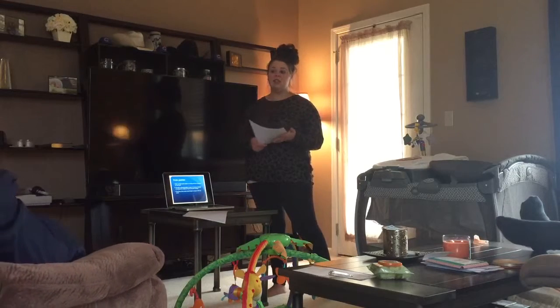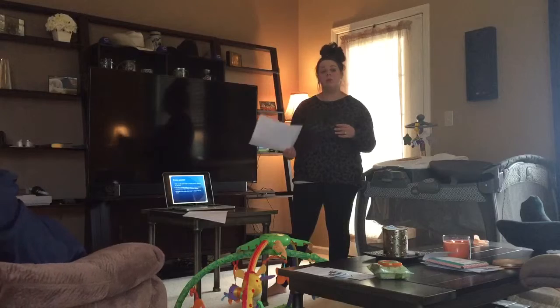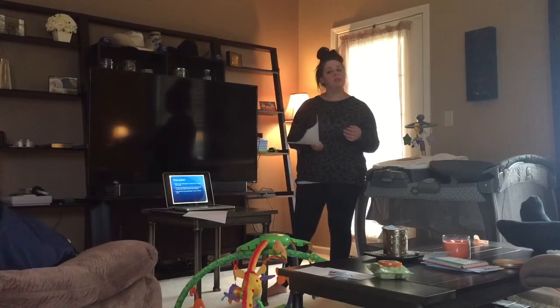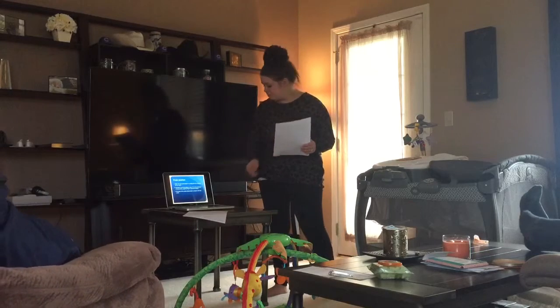Like I said, accuracy is our biggest problem with probing and the calibration, because not only do our probes need to be calibrated, us as hygienists need to be calibrated as well. We all need to be staying on the same level.